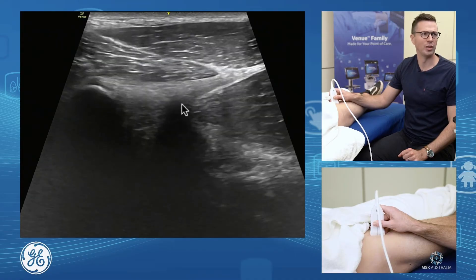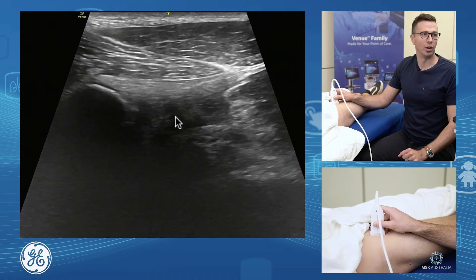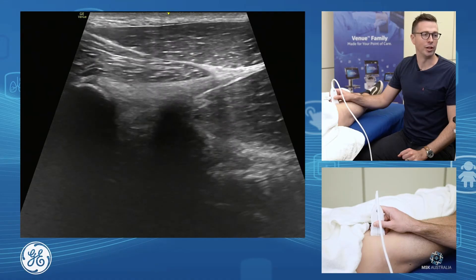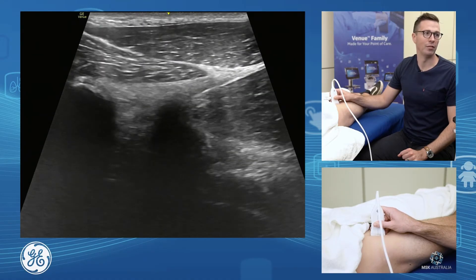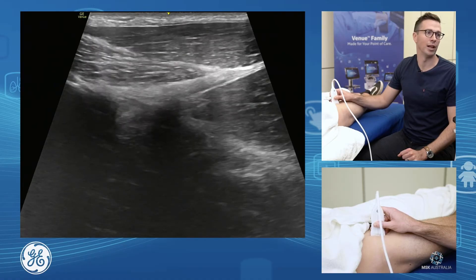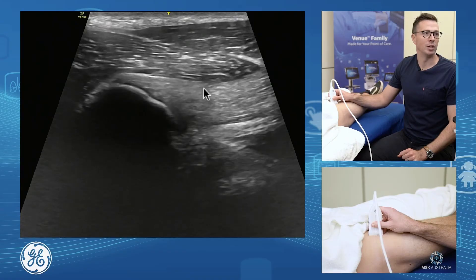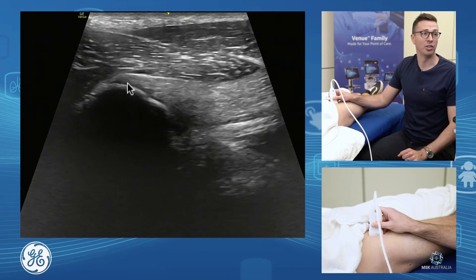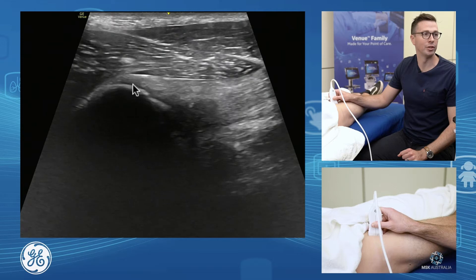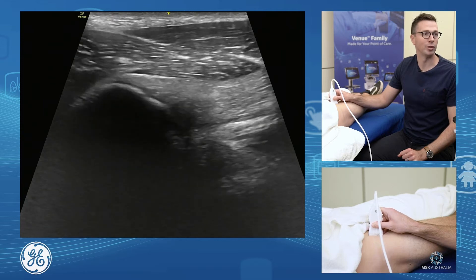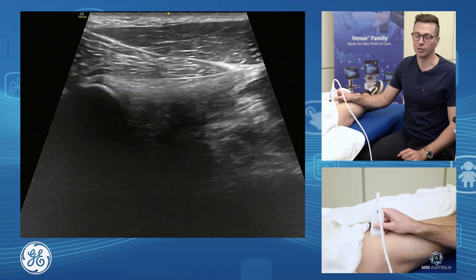We see this little bit of shadowing in through here — this is our reflected head diving down, originating on the lateral aspect of the acetabulum and the lateral labrum and lateral capsular structures. For our direct head, you can assess for apophyseal changes, traction apophysitis, and avulsion fractures of the rectus femoris direct head. Our indirect head reflects around the side.